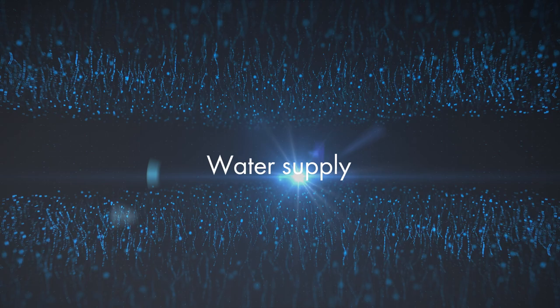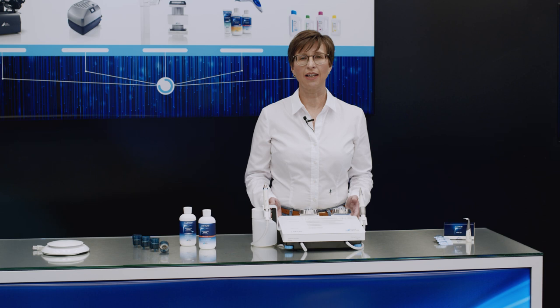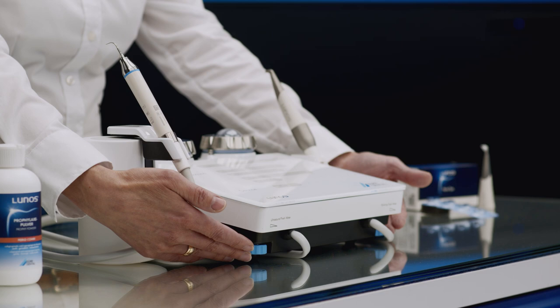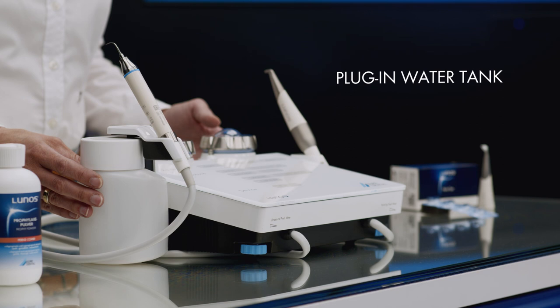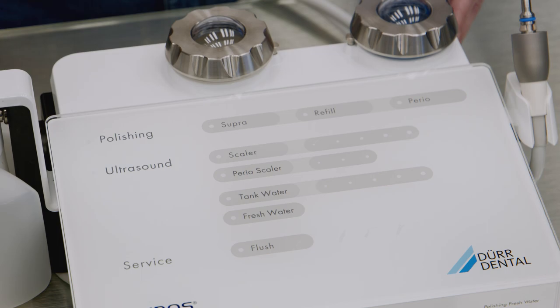MyLUNOS DUO offers two different water supply options. In the first option, the device can be connected directly to the mains water connection of the dental unit, and the amount of water is then regulated via the two dials. Alternatively, if an ultrasound application is being used, there is the option to supply the water via the plug-in water tank. The water tank has a capacity of 500 milliliters, and the amount of water is adjusted via the device display. The supplied treatment water is warmed inside the device, making the treatment a more pleasant experience.